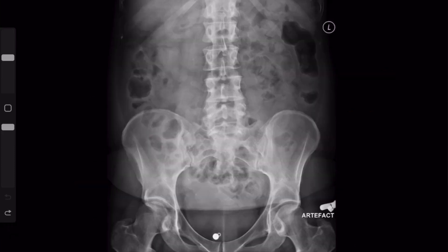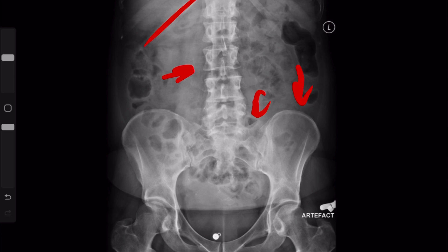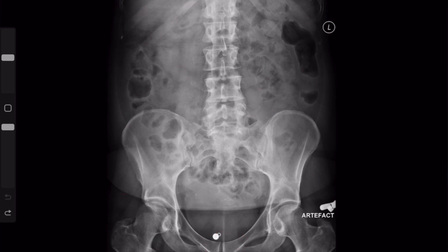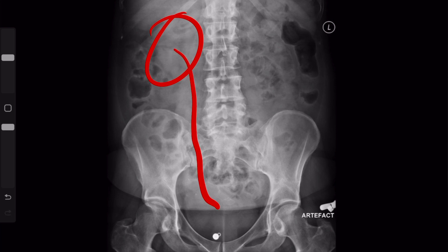After looking at the bowel gas pattern, I then look at everything else. One of the main things is the bones — the pelvis, lumbar spine, sacrum, ribs, and a little bit of the hips — and then the pubic symphysis as well. After looking at the bones, I look for calcifications. Sometimes you can catch renal stones in the areas of the kidneys or along the ureters on the way down to the bladder.